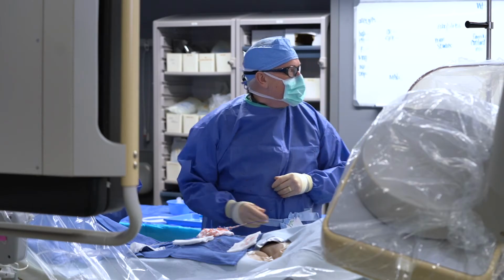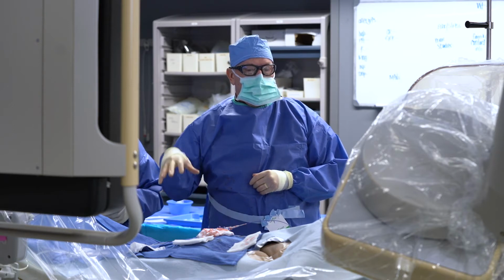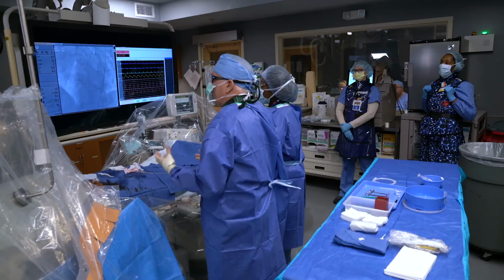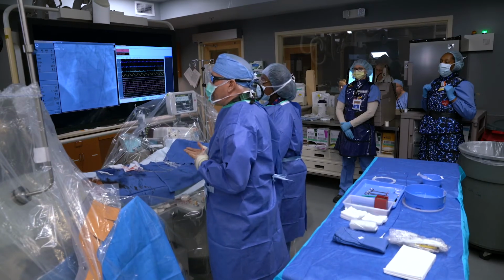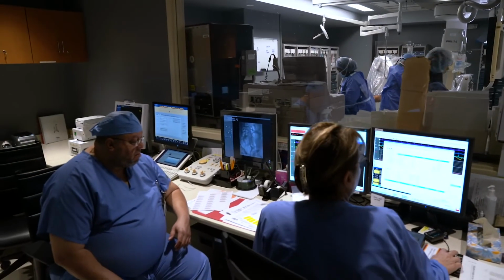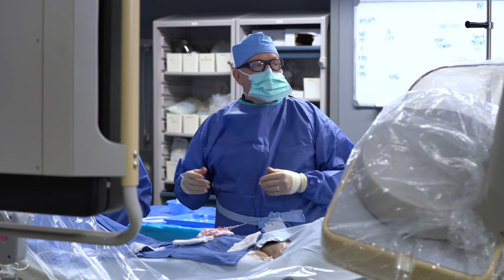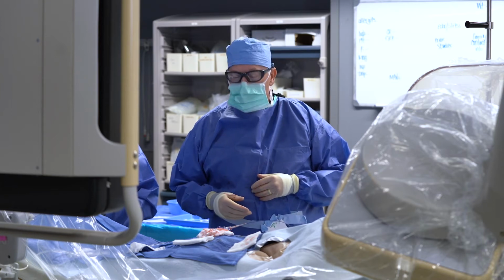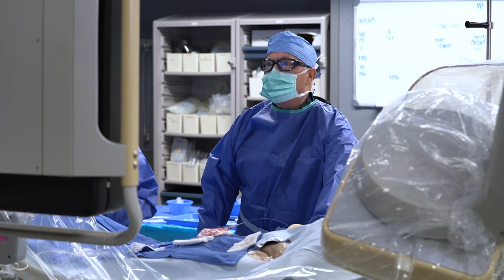Anne-Marie is my assistant here. She's a certified cardiovascular invasive technician. And then we have two nurses in here, Vicki and Vanessa, and they're providing all the medications and making sure the patient is safe and stable during the procedure. And then in the control room, Joyce and Ike are recording the information we have and are helping to adjust some of the diagnostic information that we have here too to help the patient. That's what everybody's doing here.